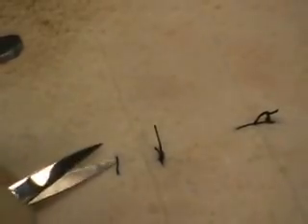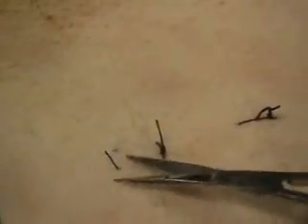I want to avoid that, so I want to go as close to the skin as I can on that side, and as close as I can go on this side, and then I'm just going to simply grab the knot and pull. Okay, so those are our simple interrupted, vertical mattress, and horizontal mattress.